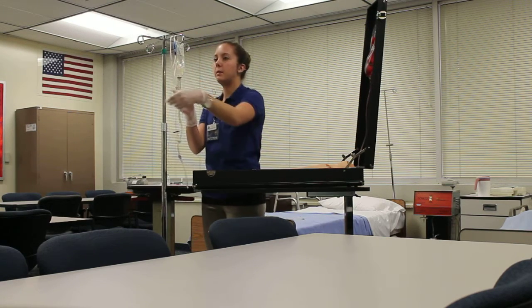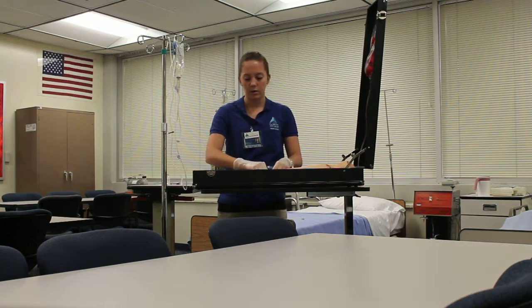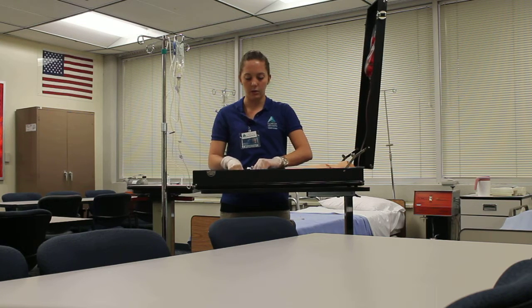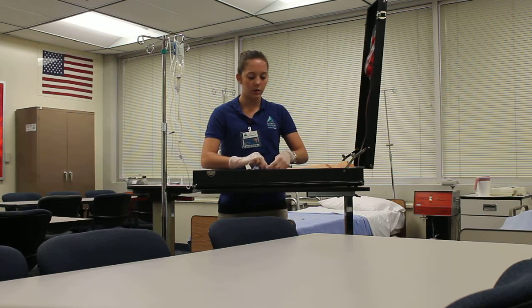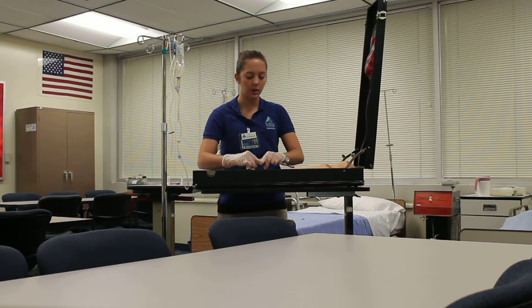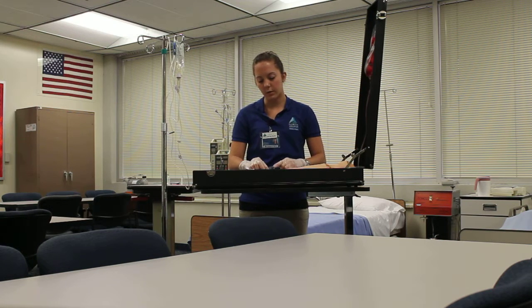I'm going to grab my 3 ml syringe again full of saline and again perform the ASASH method. So I'm going to wipe off the end of it with an alcohol swab, the syringe itself as well as the IV tube. Connect the syringe to the IV. Unclamp my IV tube. I'm going to aspirate, check for blood return. Once I've seen that, I can do the push-stop method.